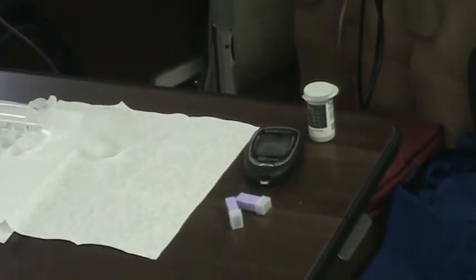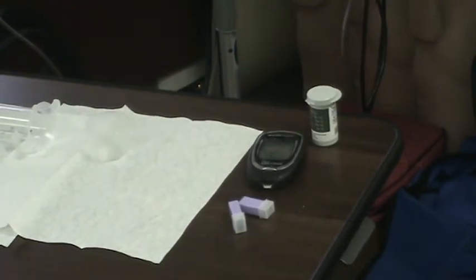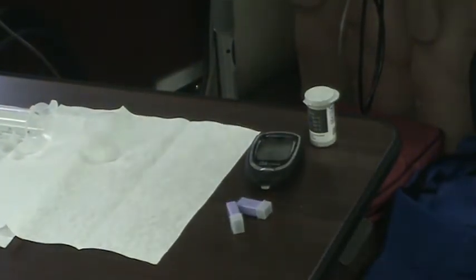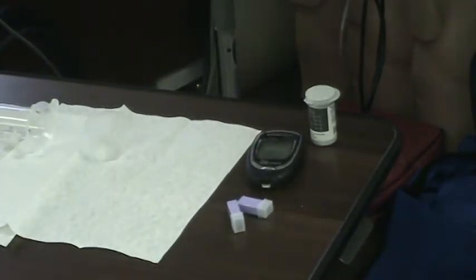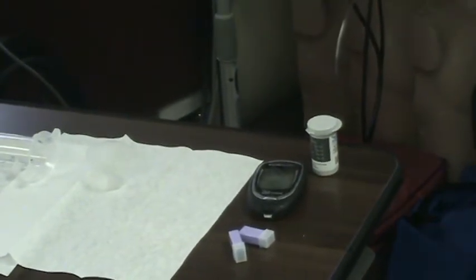Then you always have to clean the finger where you're going to get the blood with alcohol, or we'll use hand sanitizer. This hand sanitizer has alcohol in it. Alcohol is hard to get in the market now, so we're going to use that. We're going to use the cotton ball to get the hand sanitizer.